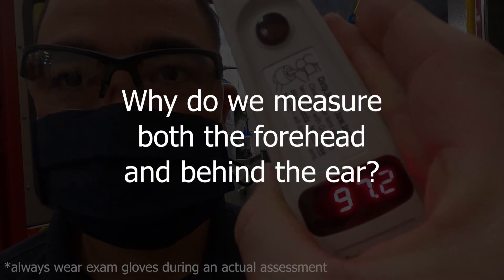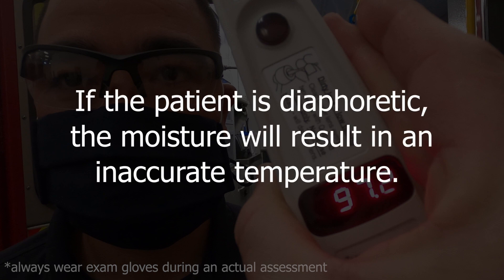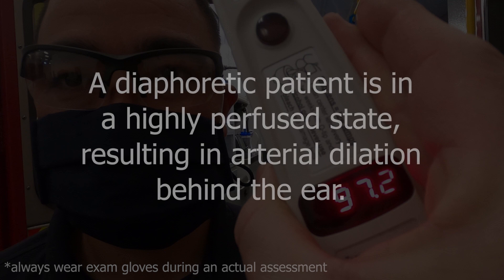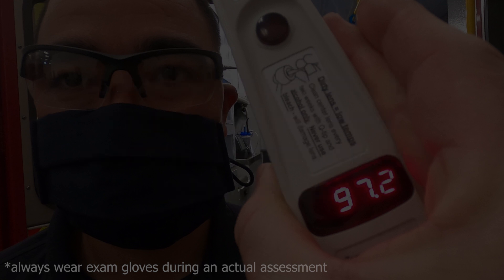You may be curious why you would measure both the forehead and behind the ear. If the patient is diaphoretic, the moisture on the forehead will cause an evaporative cooling effect, resulting in a measurement that is actually somewhat lower than the patient's actual temperature. However, the patient who is diaphoretic is also in a highly perfused state, meaning that the arteries are dilated behind the earlobe.